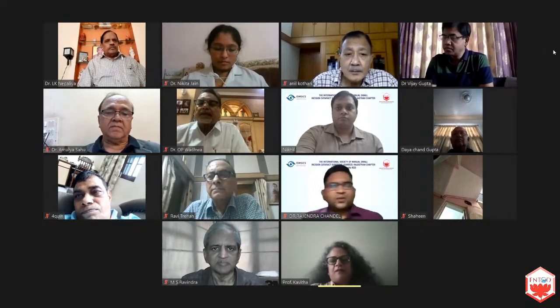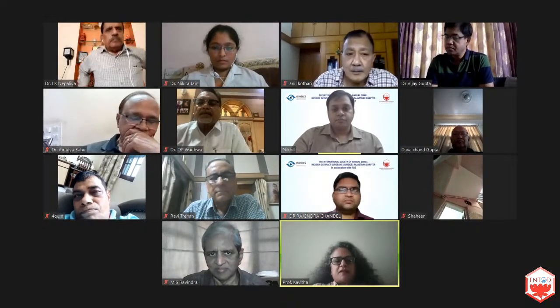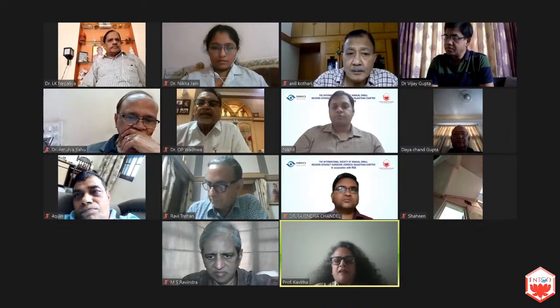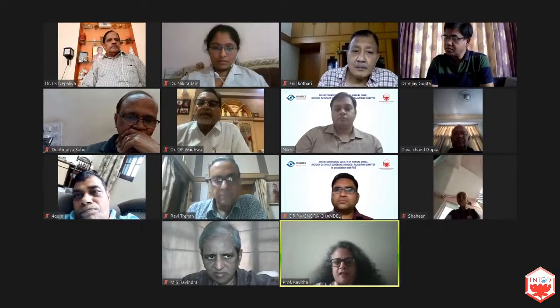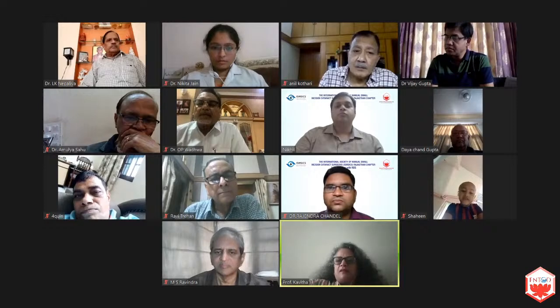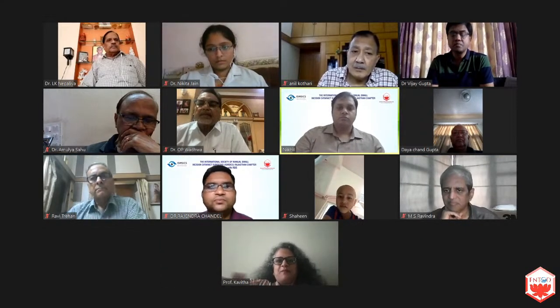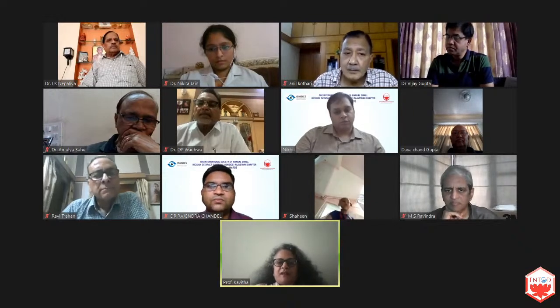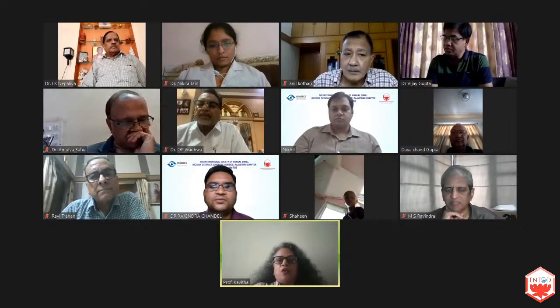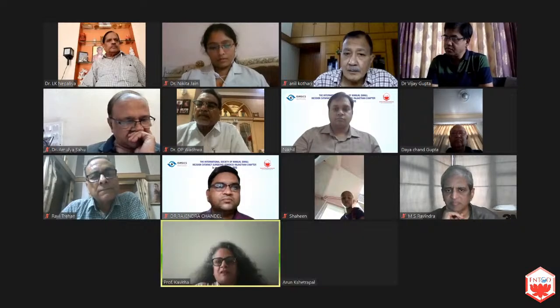Very, very lucid presentation, Dr. Nikhil. Yes, ma'am. I would just like to add a few tips for youngsters. One is, when you are making the tunnel after the initial incision, your movement should be at the wrist, and not the elbow. Another is you should dissect the tissue and not cut it. When you're making the tunnel, you have to dissect it. You don't have to cut.